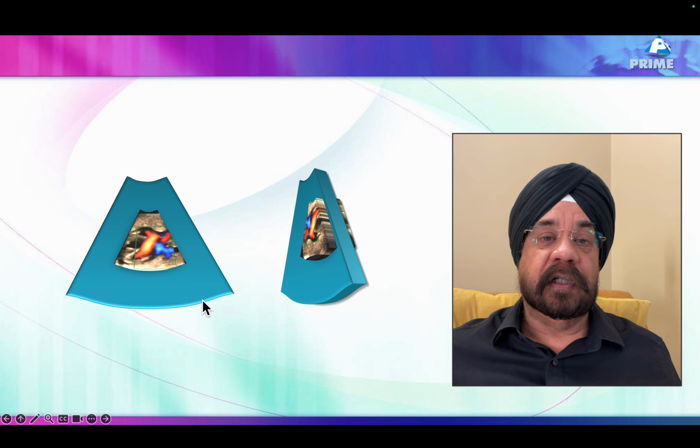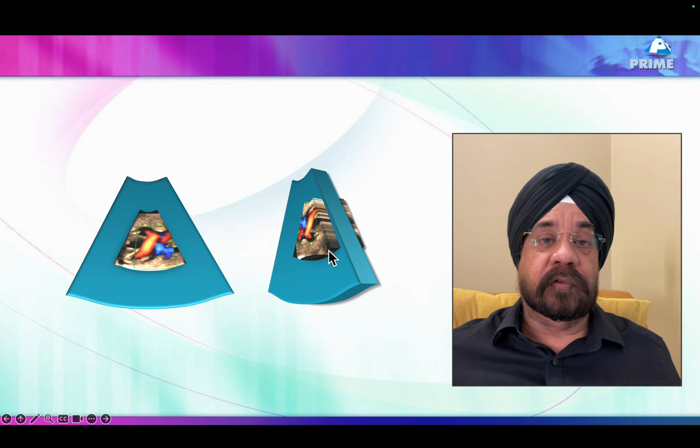For example, you think that the image you see on the color Doppler screen or your equipment screen is a razor thin image, but this is something like an old 4-slice CT machine. The structure you're seeing is a thick slice on your monitor. Thick slice means that it overlaps data from a very large thick slice, so that the data from behind and from the front are overwritten on each other, and you see this.